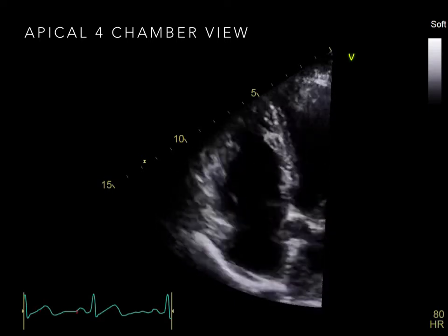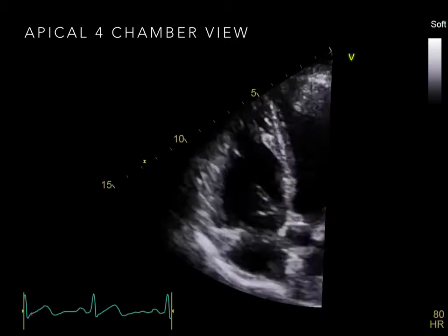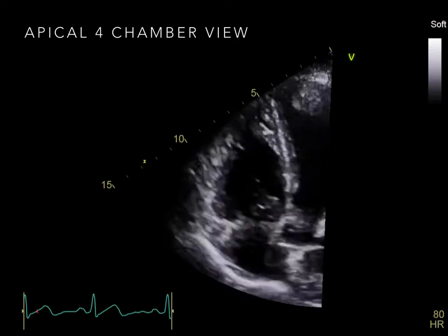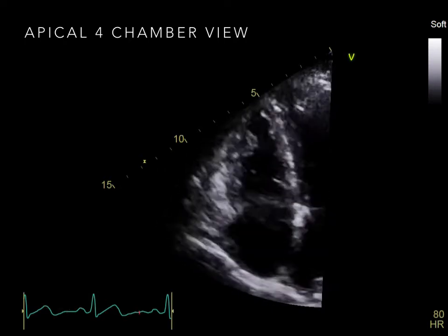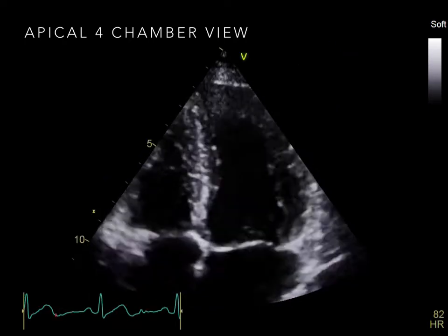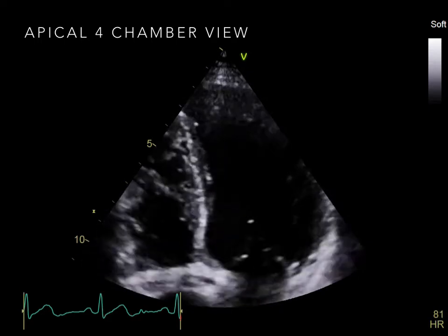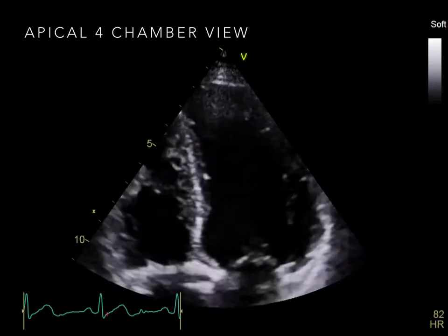The right ventricle appears triangular in shape with a cavity about half the size of the left ventricle. The lateral free wall of the right ventricle can be assessed from this view. The left ventricle appears as a truncated ellipse with the anterolateral wall, inferior septum, and apex visible.